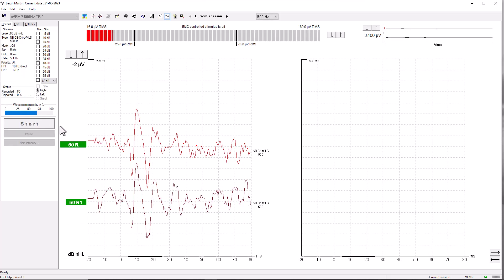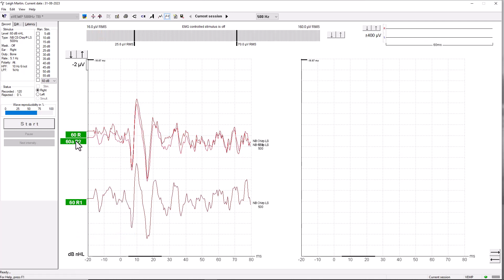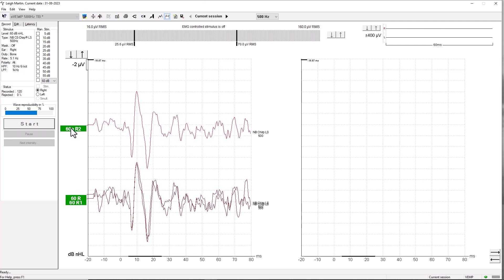I'll let Lee relax. While he's relaxing, I can take a look at both responses and select a response, then add that response to the previous recording. What we now have is a response that contains 120 sweeps combined together, so that we can identify the ocular VEMP that's present.